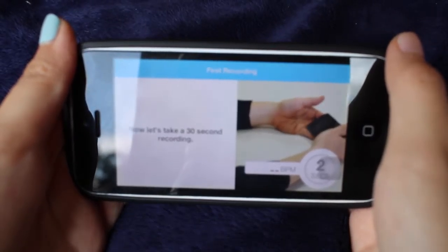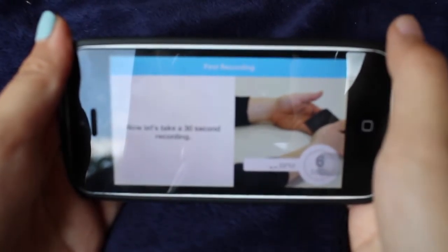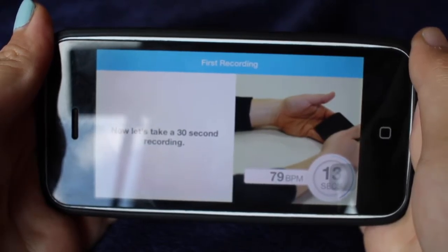You may notice a static sound coming from the case, which is normal. On the lower right part of the screen you'll notice your heart rate and a timer.